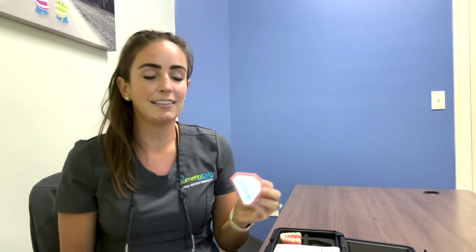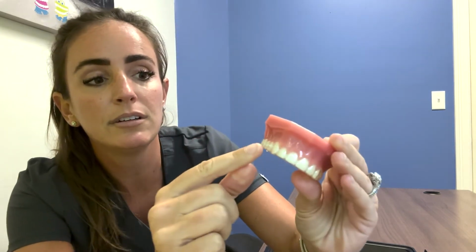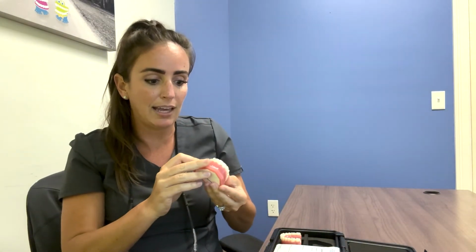So once we have the trays back, the next appointment for you will be to place the attachments, which I referenced earlier. What those are, they are these little tooth-colored filling material shapes that we put on the teeth. You can see right here and here, and same thing, you can see one over on this side here. And those are something that are necessary with certain types of tooth movement, and really it's something that I will just have to decide which teeth need them. Sometimes it might be almost every single tooth in the mouth. So that's an expectation that you have to have with Invisalign, is that it is not completely invisible, but we do use materials that make it the most aesthetic option possible.